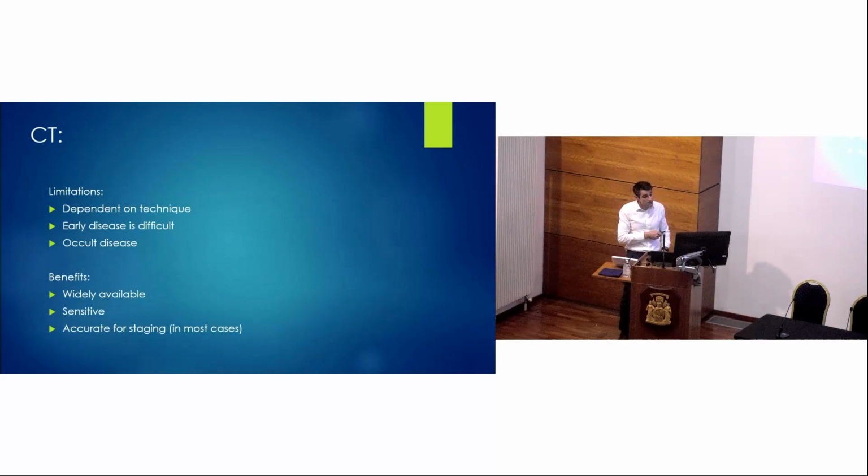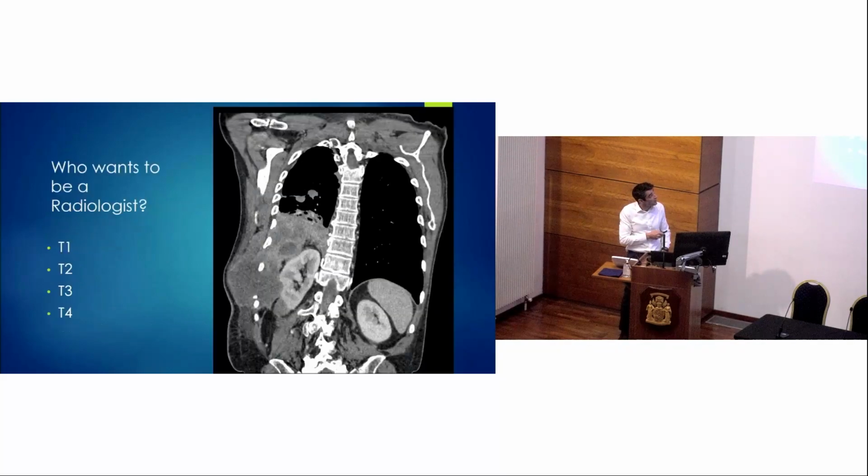Now it's your chance to have a go. We've got a couple of cases that need staged. So this is now your opportunity to be a radiologist. Now, I realise this is a bit risky, and I'm going to say beforehand that if you get this right, it's not because my job is easy, it's because the teaching was good. Okay?